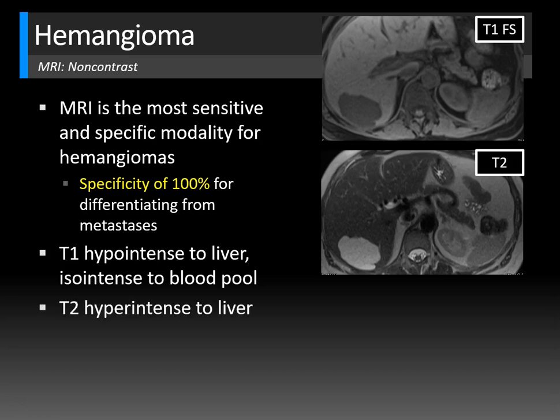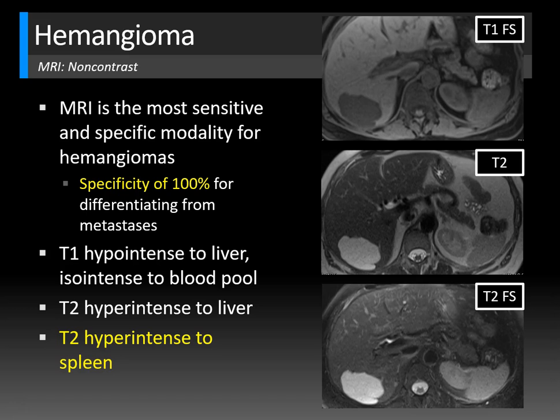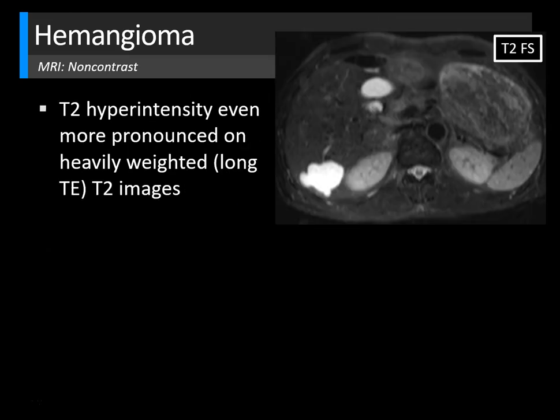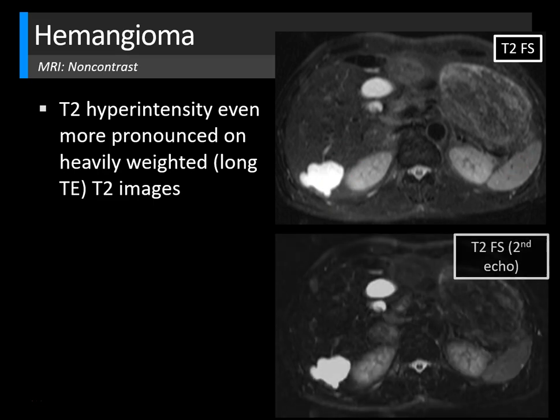On T2-weighted images, hemangiomas have a very characteristic appearance — they are hyperintense to the liver parenchyma and, more importantly, hyperintense to the spleen, which is a very classic feature for a typical hemangioma. This hyperintensity is often pronounced on T2 fat-suppressed images. It's also fairly common for hemangiomas to have a slightly lobulated contour. The T2 hyperintensity becomes even more pronounced on heavily T2-weighted images with a longer TE, which is characteristic for hemangiomas.